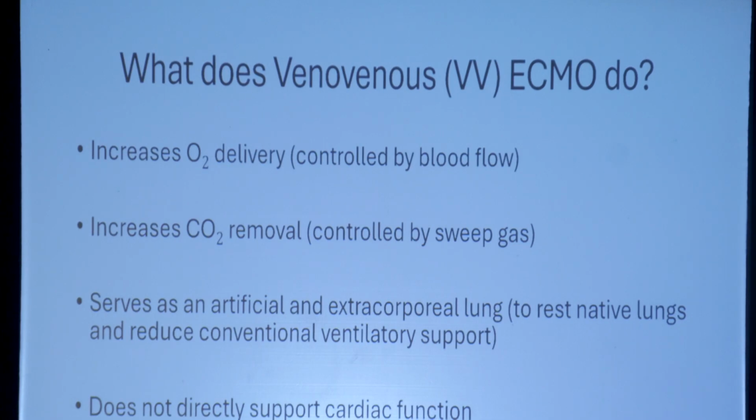But I also believe that there is a direct benefit on cardiac function by increasing oxygen delivery to the entire body, including the myocardium. So it's very common to immediately see improvement in hemodynamics once you put a patient on VV ECMO support, but not as dramatically or titratably as you would see on veno-arterial support.